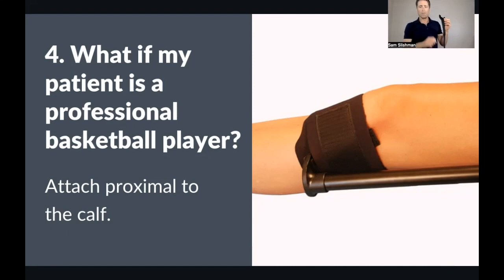We experimented with a few different mechanisms to tighten down on the proximal calf. And any kind of cinch you can pull tight and perhaps cause a problem. I think it's very hard to do that, but in any case, with this type of mechanism, you have Velcro here, and you just basically pull until that adheres, and you just can't cinch to create a tourniquet. Nobody's ever said I have tingly calf toes, some kind of neuropraxia from it.